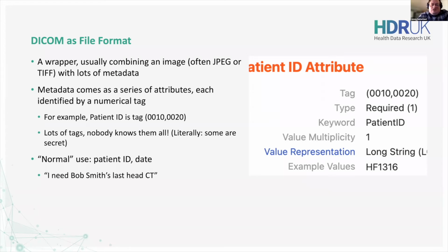But typically for clinical usage, the usage is fairly simple. That you have a patient, and obviously you know who the patient is, you know their ID or name, and you search for that and just pull up typically the most recent scan. So that's a very simple use case in technical terms.